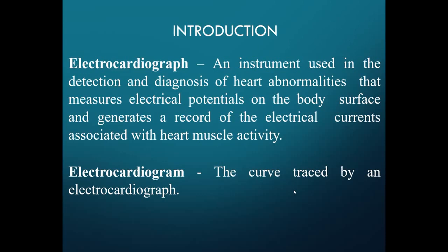That conductivity of the heart is actually the electrical impulses being produced by the conductive system of the heart, and the electrocardiograph is a machine which records those electrical currents by determining the passage of the waves through different nodes, that is the AV node, SA node, etc. If the graph does not come out as a normal graph, that means your heart is working in an abnormal condition.